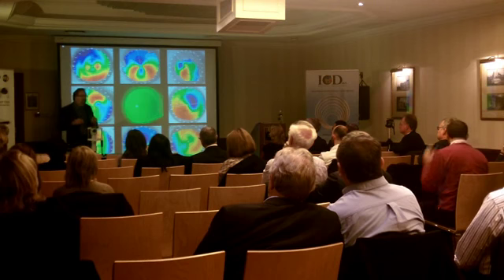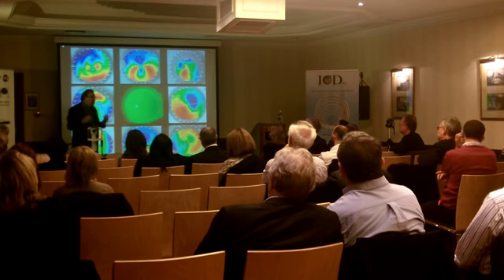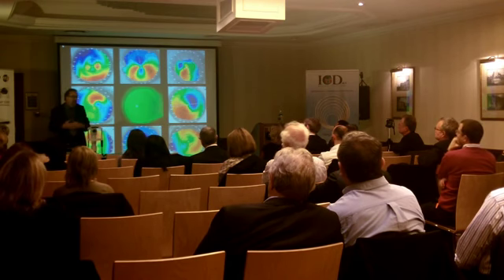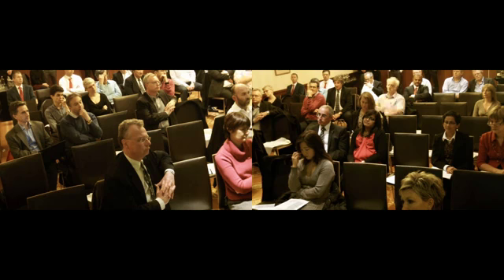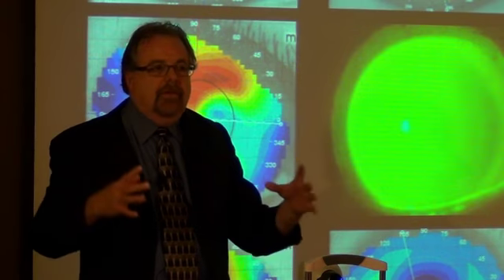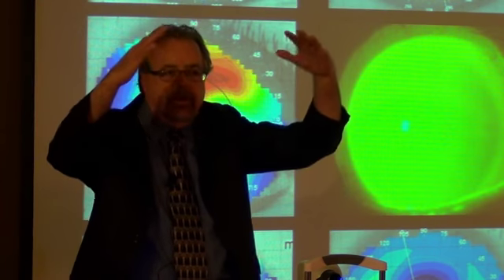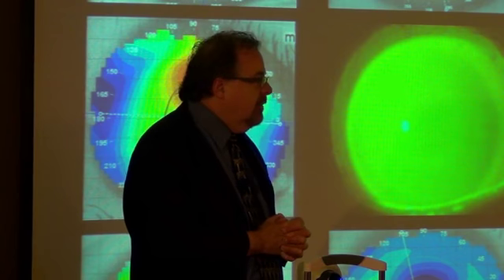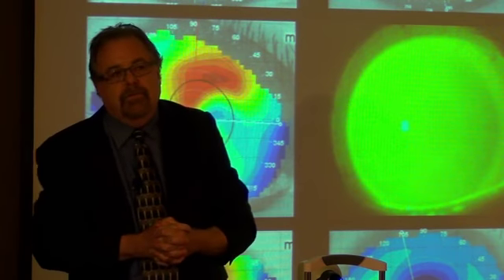Our first-year optometry students are fitting scleral lenses with the same degree of accuracy I can fit them. Just simply going through the process and dealing with these eyes with this vaulting mechanism in mind really is an easy one for them to get their arms around.